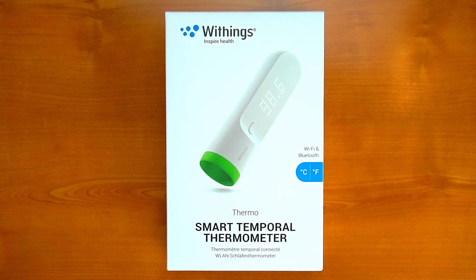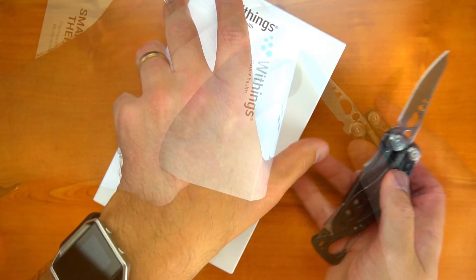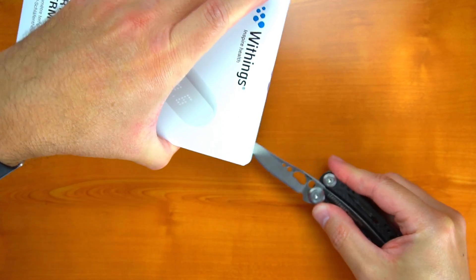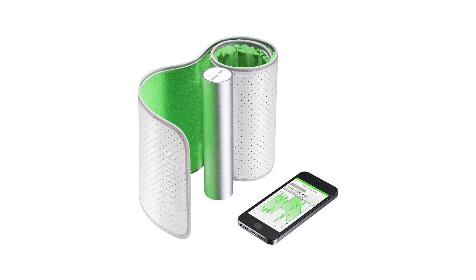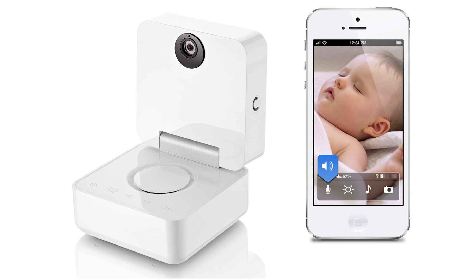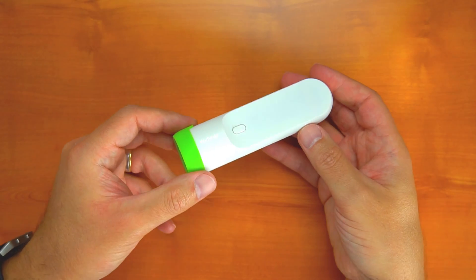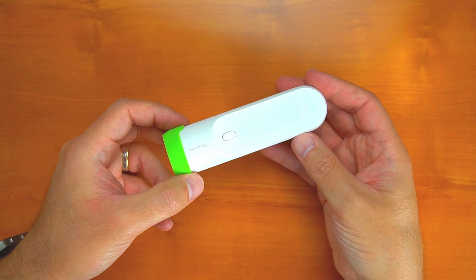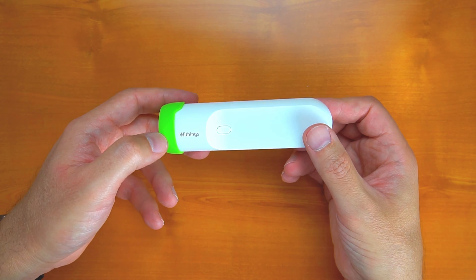If you're unfamiliar with the Withings brand, let me tell you a little bit about them. They're a company that has made a name for themselves creating smart and connected devices. They have scales, blood pressure monitors, activity trackers, and baby monitors to name a few, and now they've added the Thermo, which is a thermometer. The one thing they all have in common is the ability to seamlessly upload your data to your free Withings account.